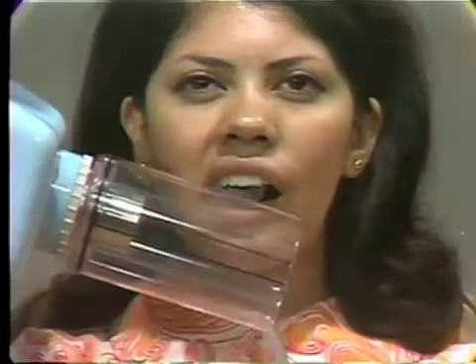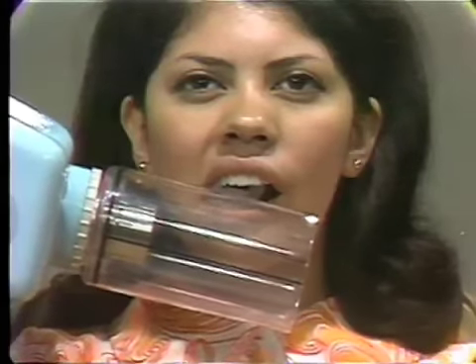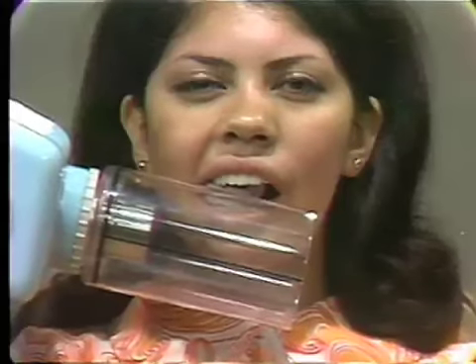The vertical angulation is determined, as we have in the past, by sighting over the top edge of the block so the cone is parallel to the top of the block. Then the next step is to determine the horizontal angulation, so we draw the machine to the side of the patient.